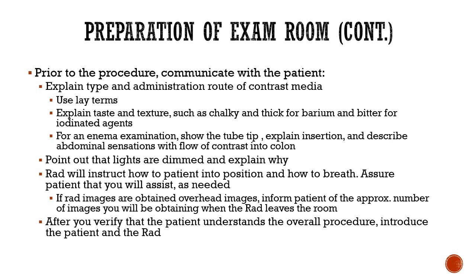Prior to the procedure, communicate with the patient and explain the type and the administration route of the contrast. Use layman's terms. Explain the taste and the texture, such as the chalky taste and the thickness for the barium and bitter for iodinated agents. For an enema exam, show the tube tip, explain the insertion, describe the abdominal sensations with the flow of contrast into the colon. Point out that the lights are dimmed and explain why.